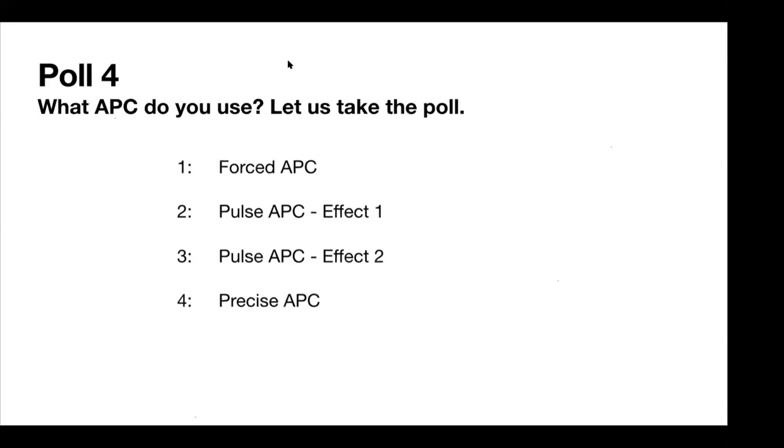So the point is that I fully agree with you. I am willing to show my ignorance, and I just tailor my usage to the effect that I'm looking for rather than being caught up in which form I'm using. So I focus more on the wattage and the amount of time I'm using, and looking for the effect I want rather than going by effect 1 or effect 2. But for the sake of selecting, I went with effect 1.